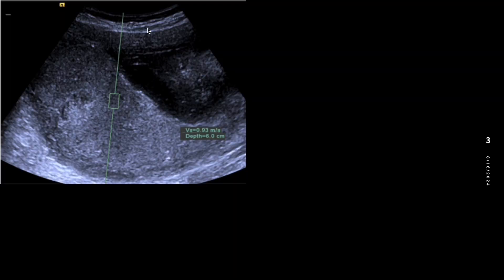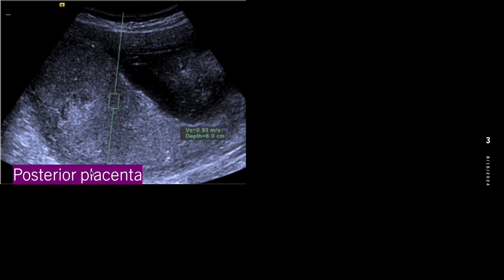Here in this image, this is the maternal uterus and these are the fetal parts. We can see that this hyperechoic structure is located in the lower part of the image, which means it is located in the posterior position. So if this hyperechoic structure is located in the lower part of the screen, then this is called posterior placental position — this is posterior placenta.